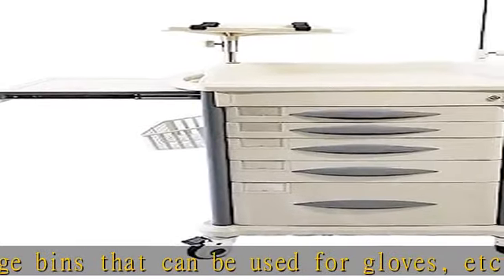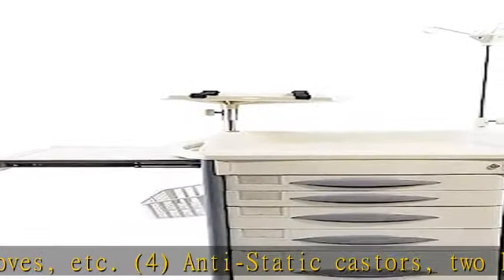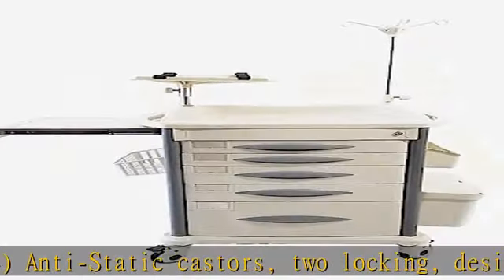2 small drawers: 16.5 in W x 14 in D x 3.5 in H.